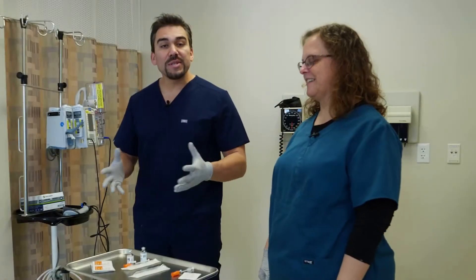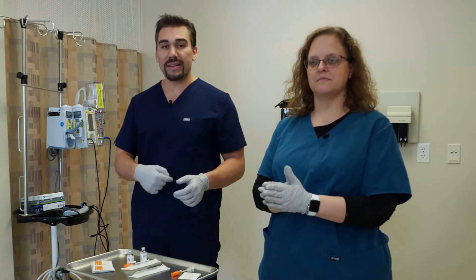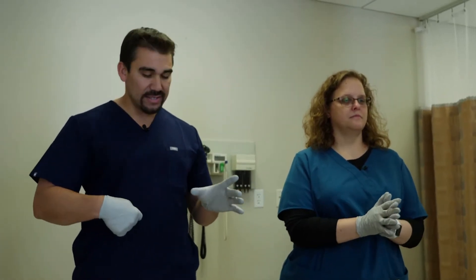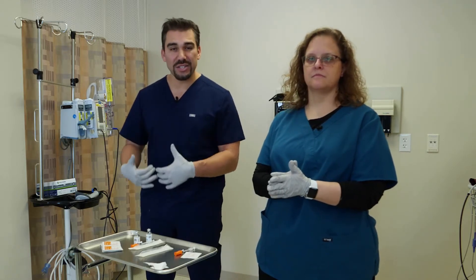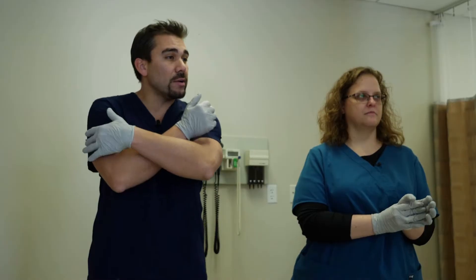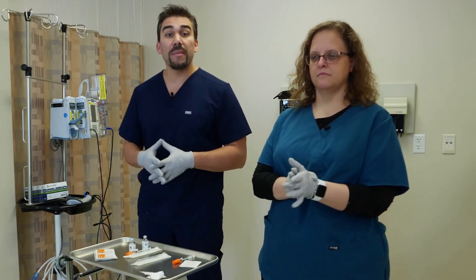When it comes time to actually stick the patient with the insulin, we always want to make sure our first choice is going near the umbilicus — fancy words for the belly button. We always educate the patient to switch sites every single time they do the injection to make sure we're not causing scar tissue or any unnecessary damage. We can also give the injection on the love handles and even the fatty portions of the back of the arms and the upper thighs. To help you remember, we do the Macarena dance.